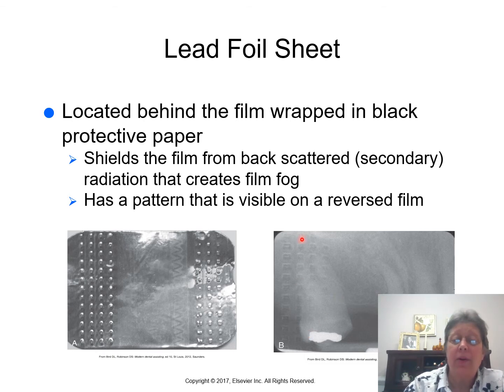But this pattern that we see here, we call a herringbone pattern. And this is just an error that was caused by whoever took the x-ray. Instead of having the white part of the film packet face the tube head, they had the two-tone colors, or what's called the label side of the film, facing the PID.